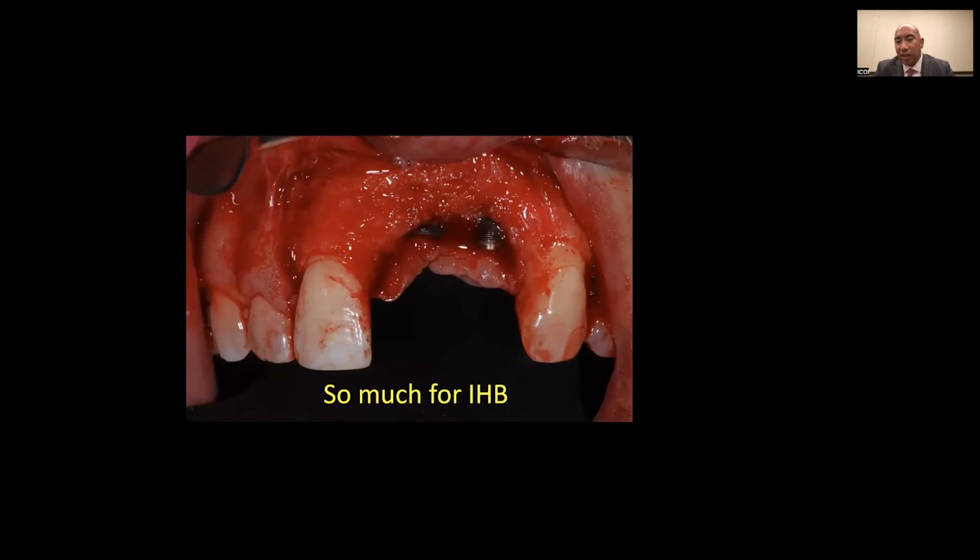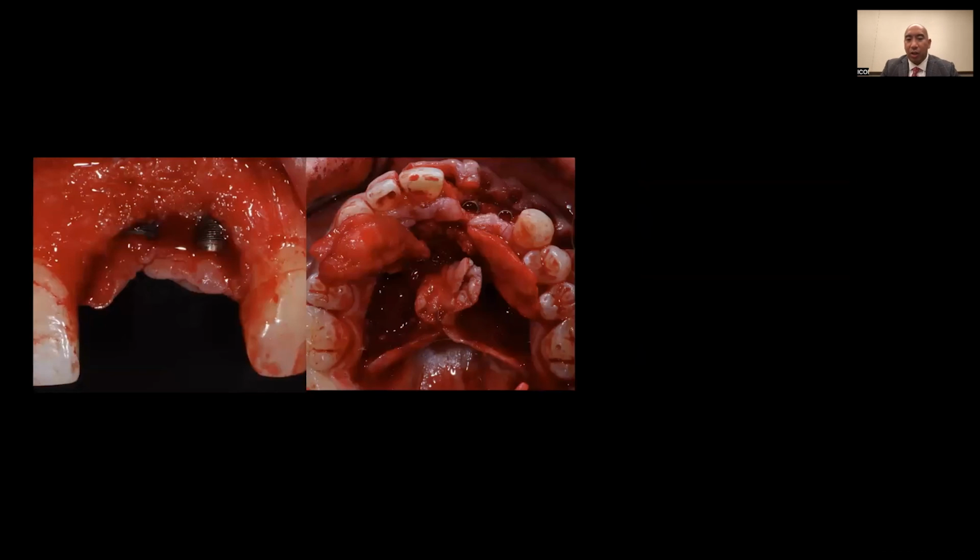So with the flap reflected, there's no interproximal height of bone between the 2 implants. So I had to get a little aggressive with the soft tissue. So here I chose a graft that's called once again, the VIP CT graft, vascularized interpositional connective tissue graft. Doesn't sound as cool as fat sack, but that's okay.